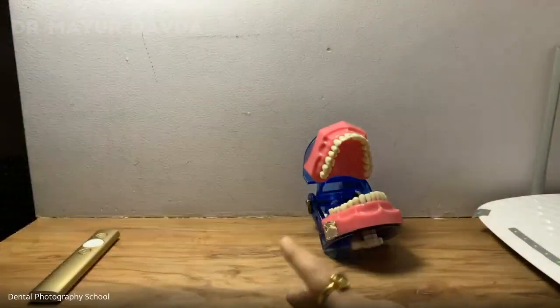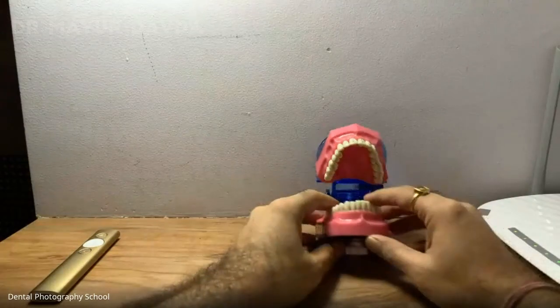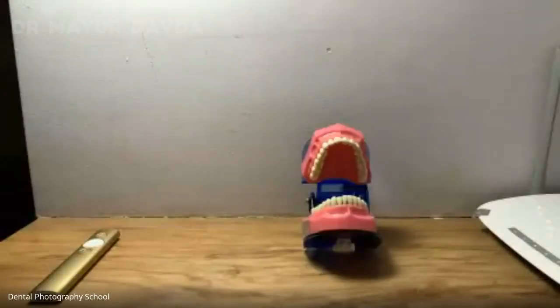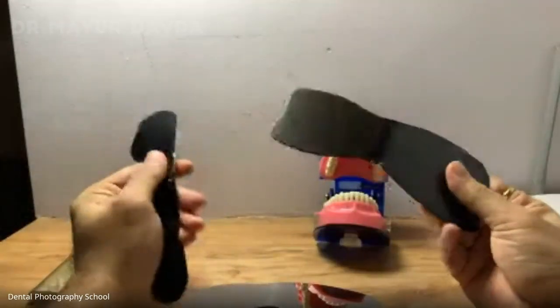All right. And now we answer one important question: how do we get a black background intraorally? So now we come to the most important topic of intraoral accessories. What kind of intraoral accessories should you invest in? Number one, if you want a black color background, you have to invest in something called contrastors.